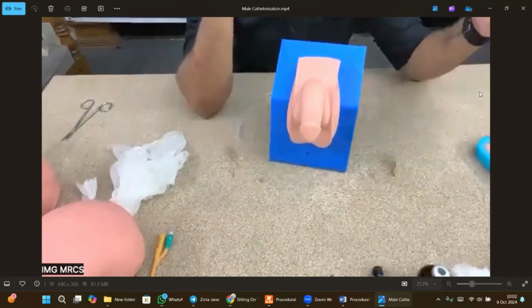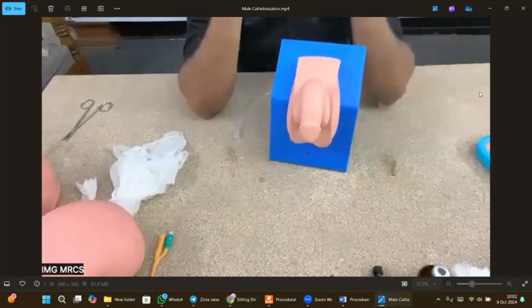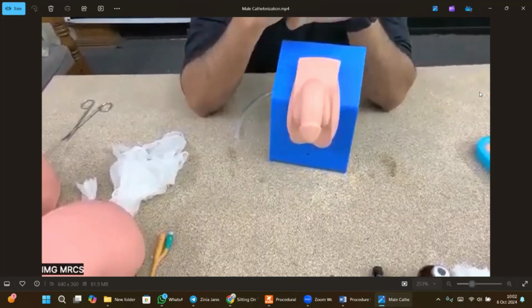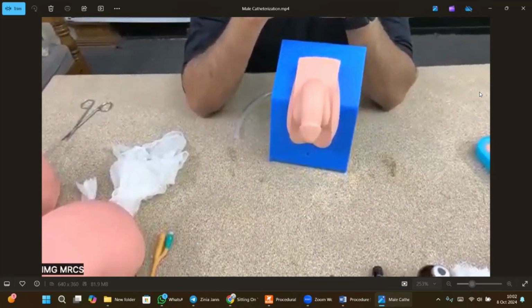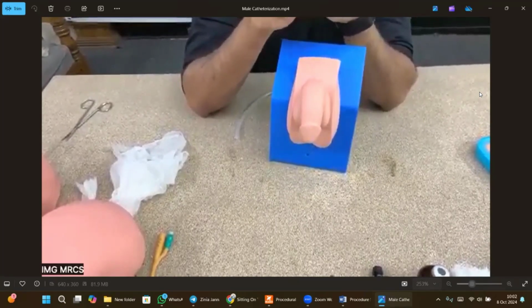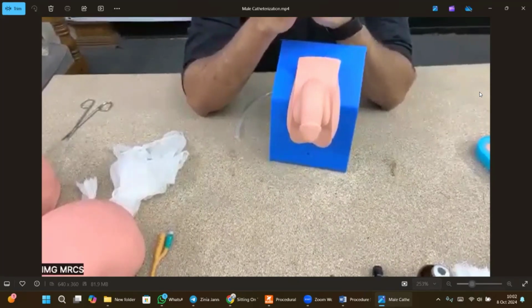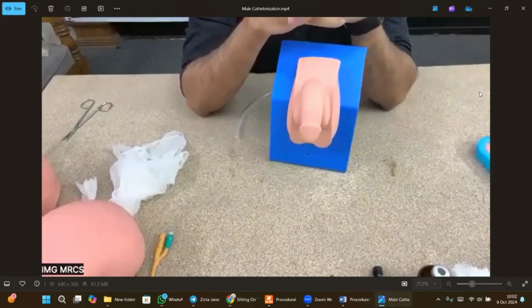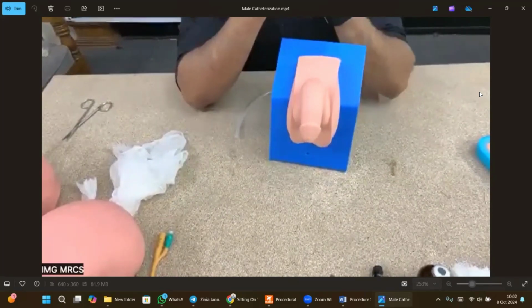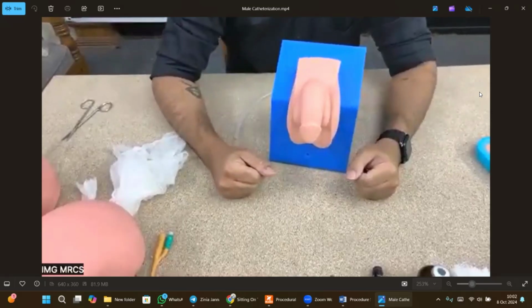After that, you have to arrange your equipments. Okay, what are the equipments you need? First of all, in this station, you are going to have a basic catheter pack, which will be given by the assistant, and you will have some kidney dish, gallipot, gauze, sterile drape, skin preparation solution. You're going to have 2 pairs of gloves in this station particularly, and you have to change your gloves in between your procedure itself, okay. I will mention when you have to change that.